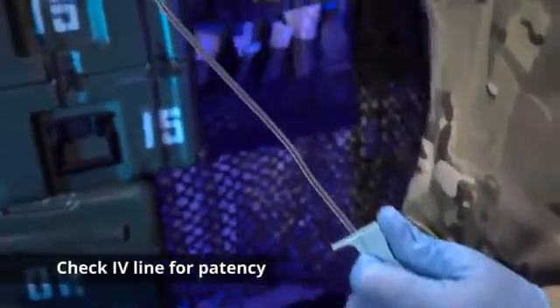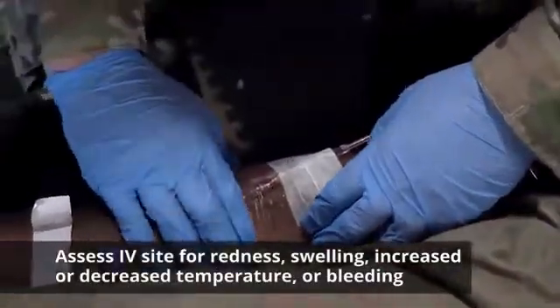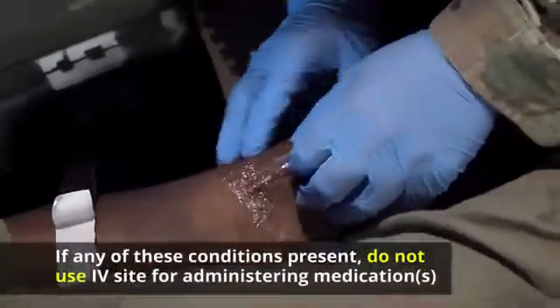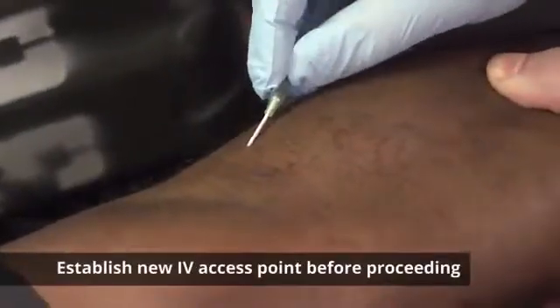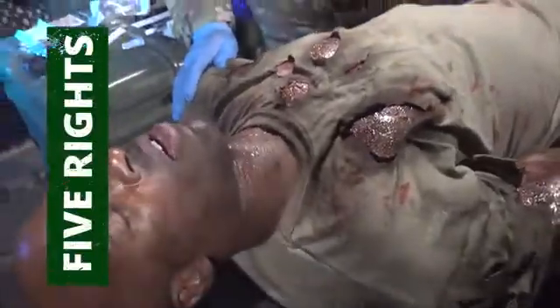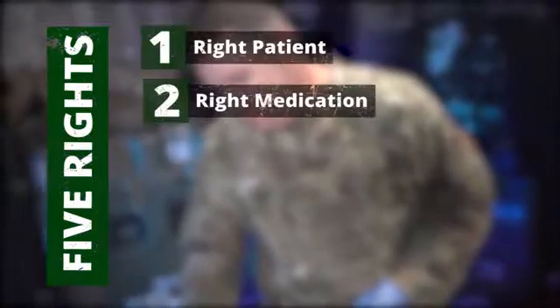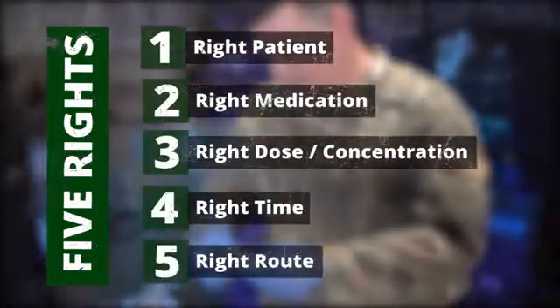Check the IV line for patency. Assess the IV insertion site for redness, swelling, increased or decreased temperature, or bleeding. If any of these conditions are present, do not use this IV to administer the medication and establish a new IV access point before proceeding. Next, verify the 5 rights of medication administration: the right patient, the right medication, the right dose and concentration, the right time, and the right route.